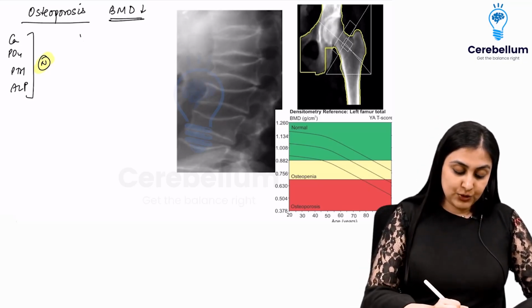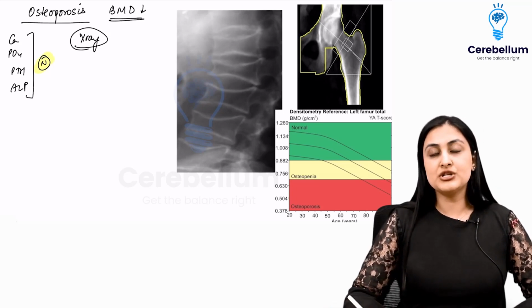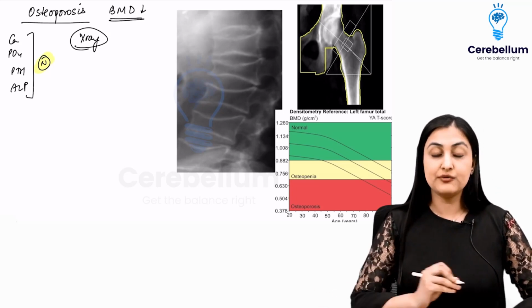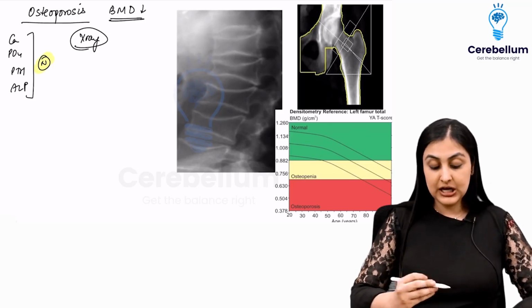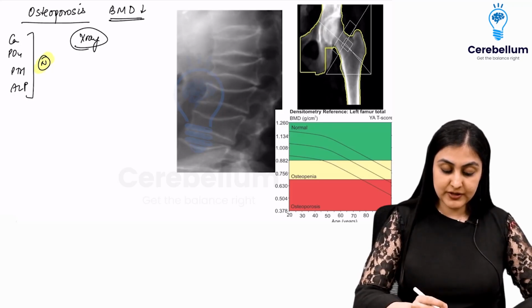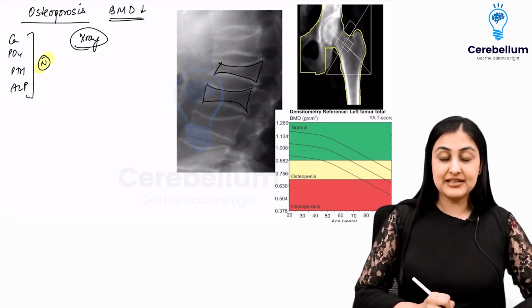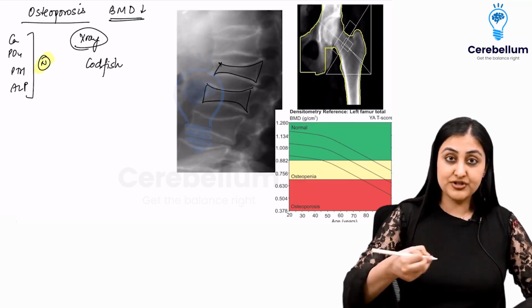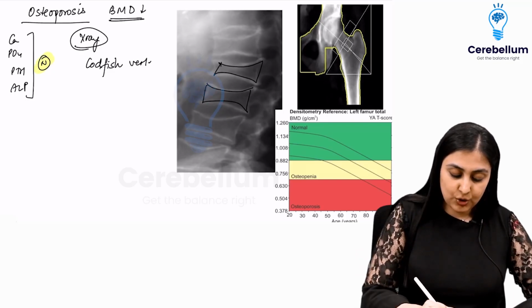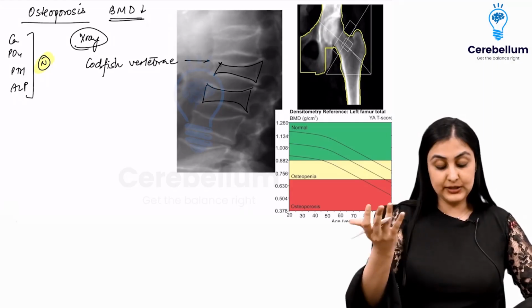Then what can we do? We can do an X-ray. Usually the females would be postmenopausal females here who are presenting with low backache, because spine is one of the most common areas to be affected. You do the X-ray and what you observe is that all of the bones are very weak. They are all deforming by the axial load, and this shape here is called codfish or codfish mouth vertebra. So codfish vertebrae here, wherein they are deformed because of the axial loading.